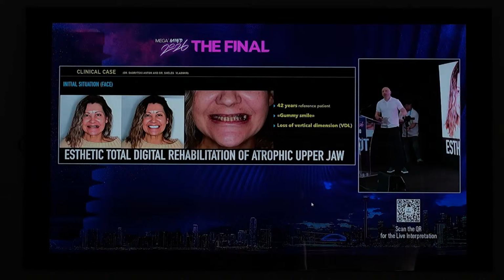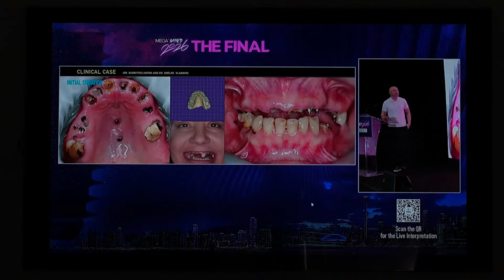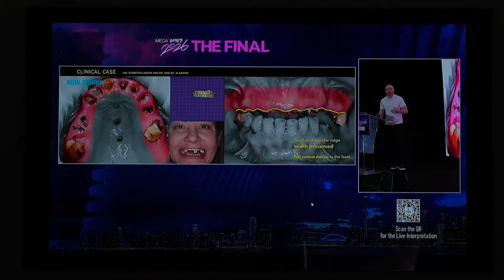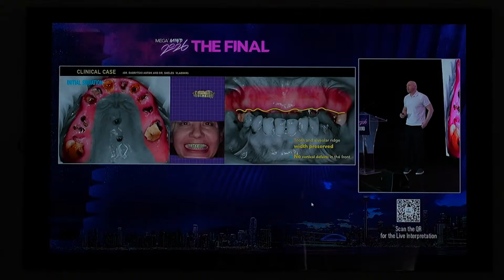You can see the alveolar ridge during the wide smile. It helps us very much when we try to plan the total implant-supported rehabilitation. If we examine the oral cavity, we can see the destroyed teeth on the upper jaw. But for us, as practical specialists, the presence of tooth roots means the presence of bone volume of the alveolar ridge, and the absence of vertical bone defects on the upper jaw.